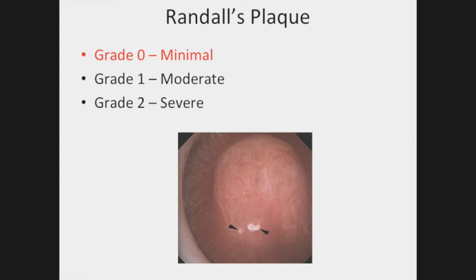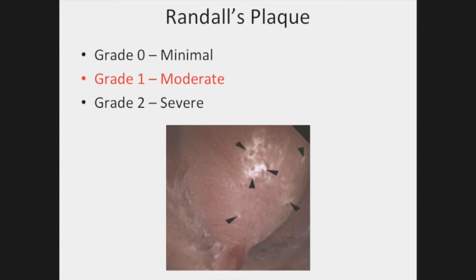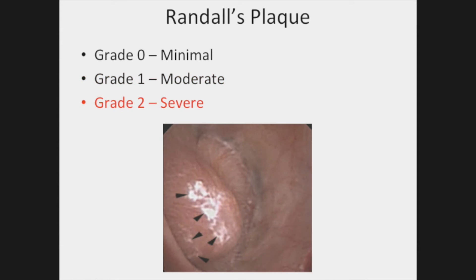Randall's plaque is classically apparent as a white interstitial calcification near the papillary surface. Minimal amounts can occasionally be seen even in non-stone-forming patients, and as such, when trace Randall's plaque is present, a score of zero is assigned. When a moderate amount of Randall's plaque is seen, a score of one is assigned, and when a severe amount of plaque is seen, the papilla receives a score of two for this domain.